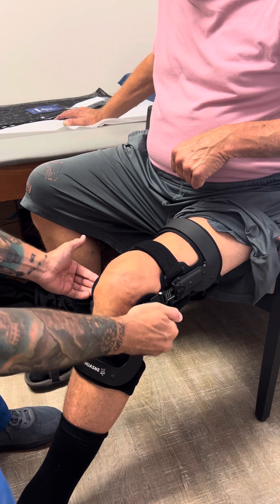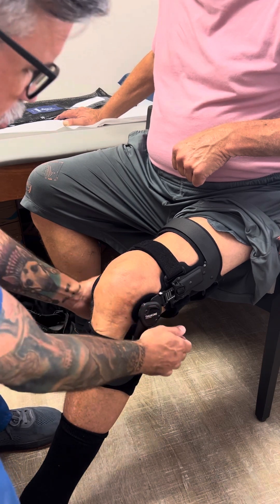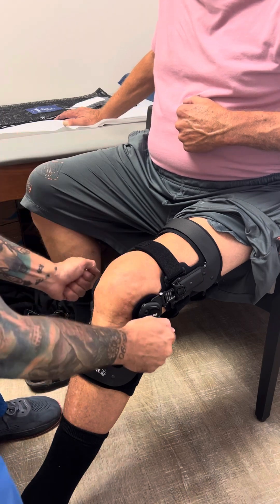This guarantees that the hinges will be in the appropriate spot, because if a patient has to do the front and back straps, the hinge could be too far forward or too far back. So it's nice to just set it up so they only have to drop it on.